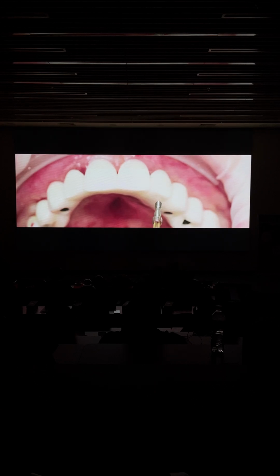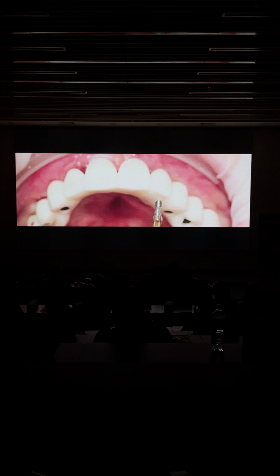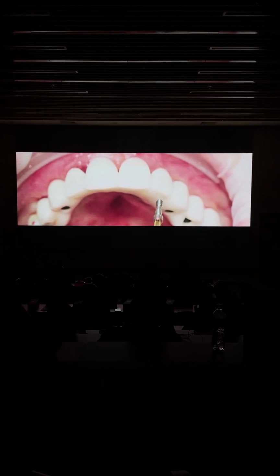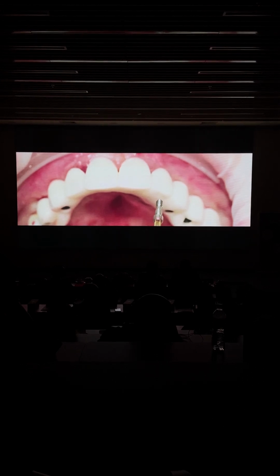In that way I can guarantee I have a perfect idea that the bridge is just fitting my implants and my crowns. And here we came up with an ideal scallop, and then I will have to place my margin underneath the soft tissue in order to meet the scallop that we have decided on in the lab.